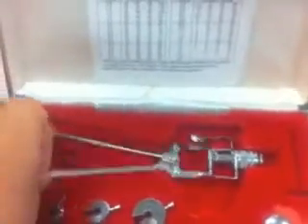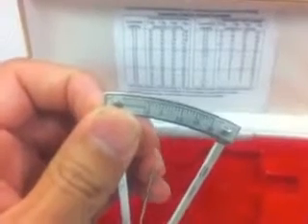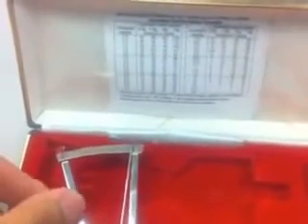If we pick up the tonometer and take a look at it, you can see that on the top here, we have the grading scales from 0 to 20. And when you get a measurement, the needle should point to one of these numbers, and then depending on which weight you have, we'll go to the scale and find out what the exact intraocular pressure is.